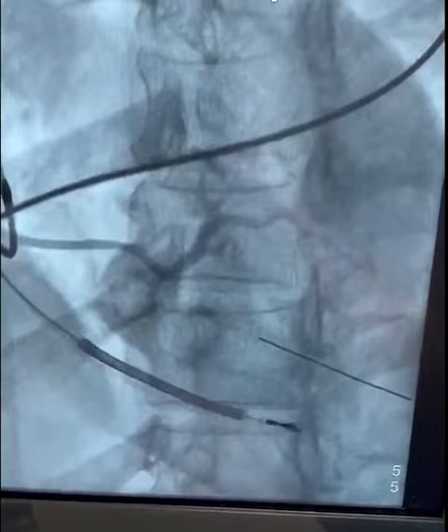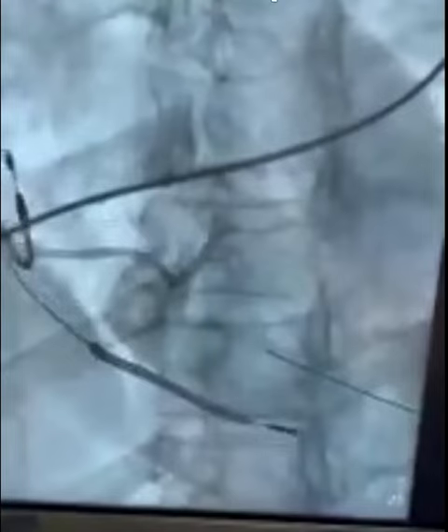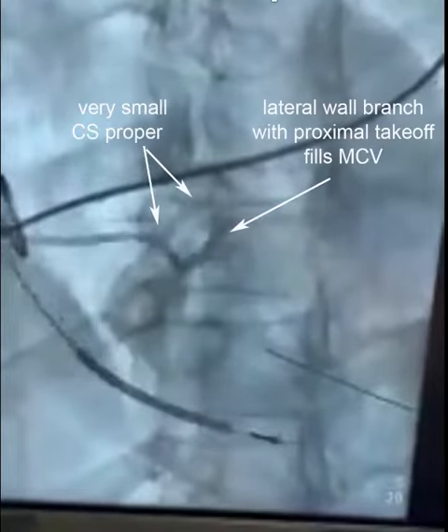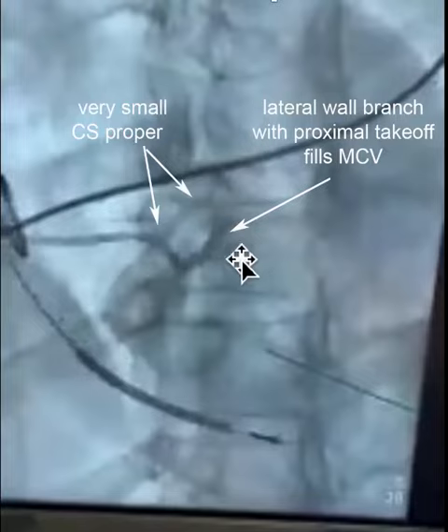This video came up on Twitter and the question was, what is the anomaly? At first I thought it was CS atresia, but on more careful examination, I realized that this is a situation where you have a very dominant middle cardiac vein and that the catheter is engaged a side branch, a lateral wall branch, just off the ostium of the CS.